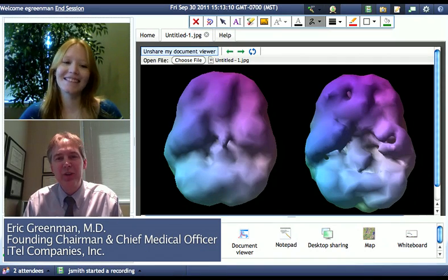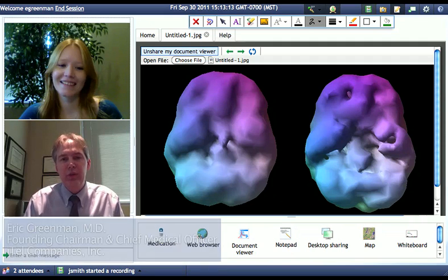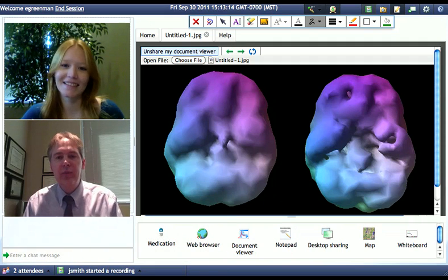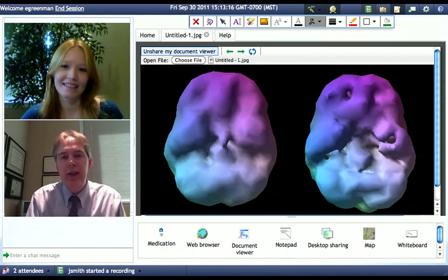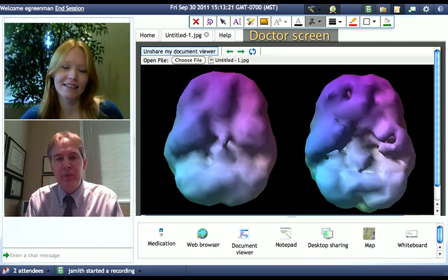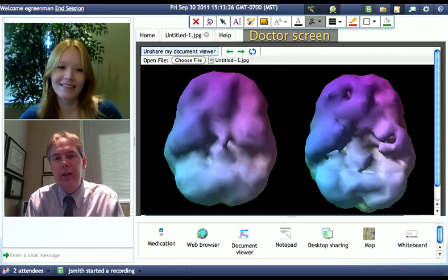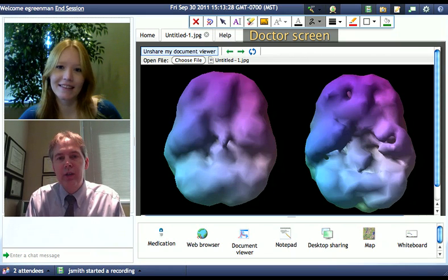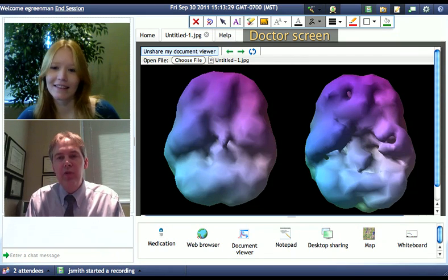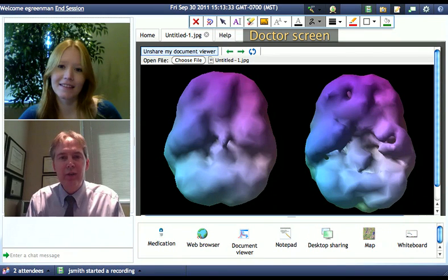Hi, I'm Dr. Eric Greenman, founder of ITEL. Today we're reviewing some of the image sharing capabilities, looking at brain images from the Amen Clinic, and these are SPECT images. We're looking at a normal brain on the left and an ADD brain on the right, and SPECT images are functional scans that give us some information about relative brain activity.